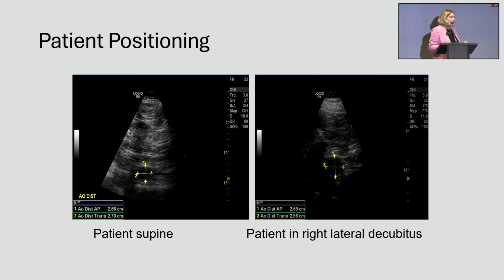Now this is where that coronal view comes into play in a very big way. You have a patient, and I bet in Tennessee you have a few abdomens that are bigger than you would like. If you're standing there trying to push down through that tissue and it's hurting you and the patient, your shoulder is screaming, turn them on their side. Turning the patient into a right lateral decubitus and coming at that aorta again, you've lost 5 centimeters of depth. Don't try to power through that big abdomen, especially if it's fairly solid. Squishy fat is a whole lot better than hard, solid types of tissue underneath.